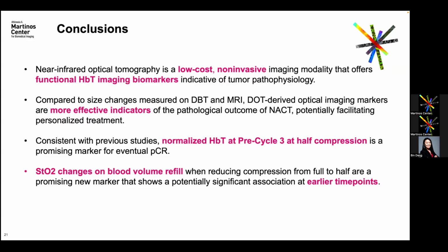The purpose is that X-ray mammography is the first-line screening tool for breast cancer, and by integrating an optical imaging device with that, we expect to have the widest reach to potential patients. Other groups integrate optical imaging with ultrasound and MR, all three major breast imaging techniques. But that's just our choice. Thank you.